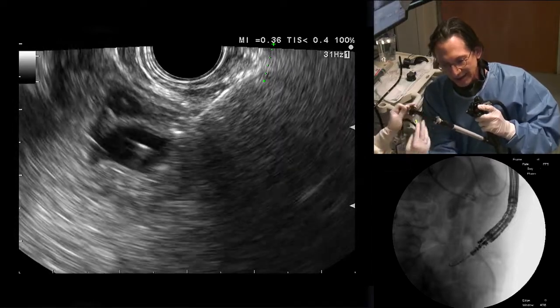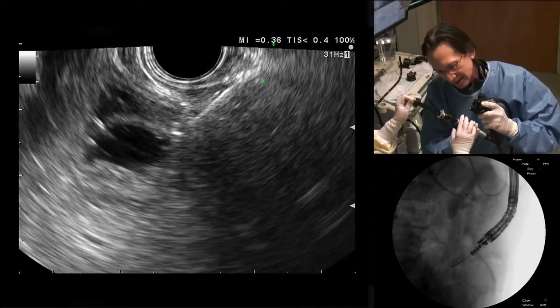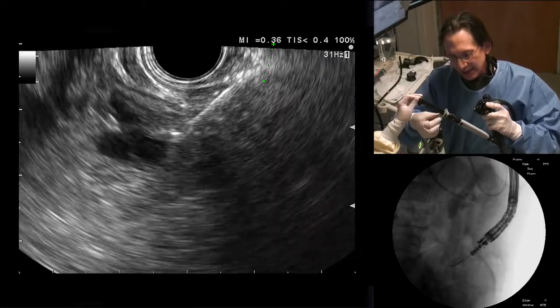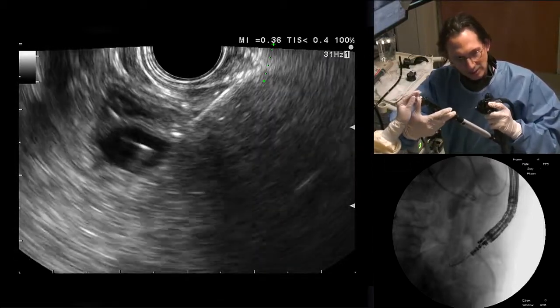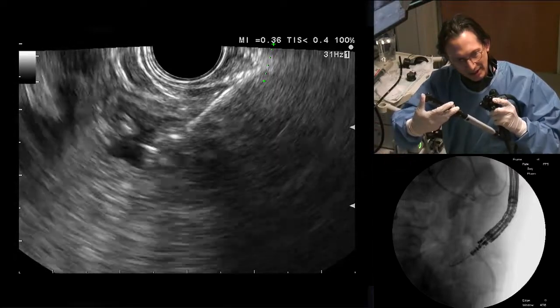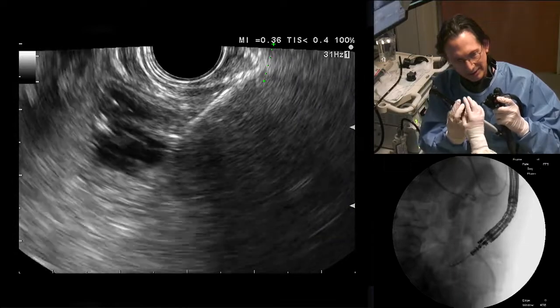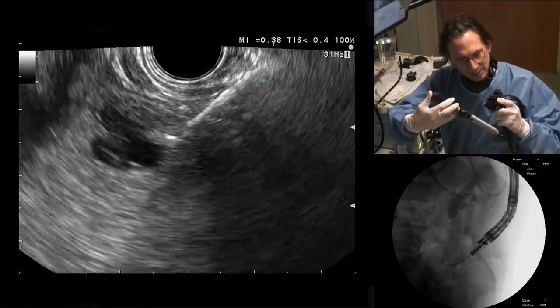You'll leave the wire in. And the way that we do this is we have this, is this unlocked? No, it's locked. Okay, unlock it, please. So this is on the opposite side. We're going to keep this stable, and I'm just going to advance this part. So let's look on the EUS image as I'm doing this. This is unlocked. I'm sorry, can you unlock this? There it is, unlocked now. Okay, and this I'm keeping stable, and I'm just pushing this forward.